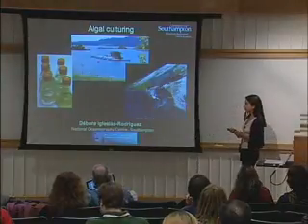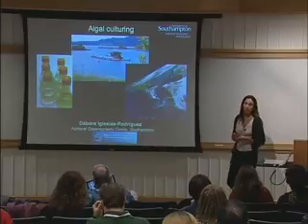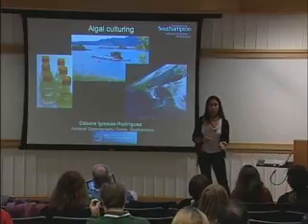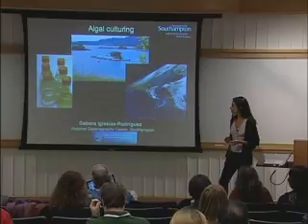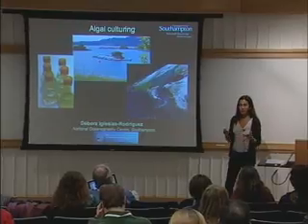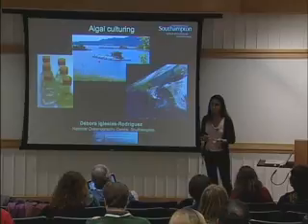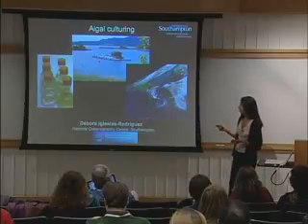So here you have some cultures of phytoplankton, typically clonal cultures that we use to test our hypotheses. More often than not, we assume that these clonal cultures behave the way we describe the species concept for that particular functional group. For example, I work on Emiliania huxleyi, for which you can see a bloom here.